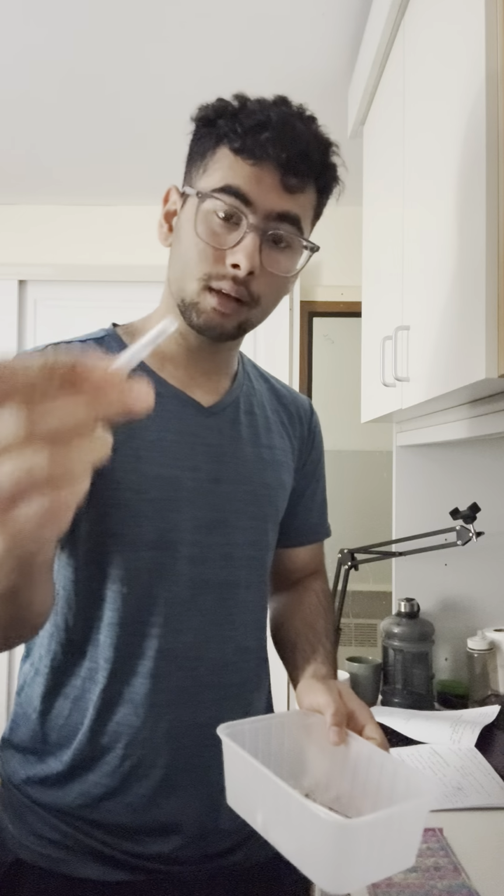So you need this syringe. I already took it out of the packet. This is the needle. Take it out of the packet. This is a 25 gauge needle, and always make sure that you are checking the dates, how much dose you are giving, checking randomly, like taking out from the bucket.